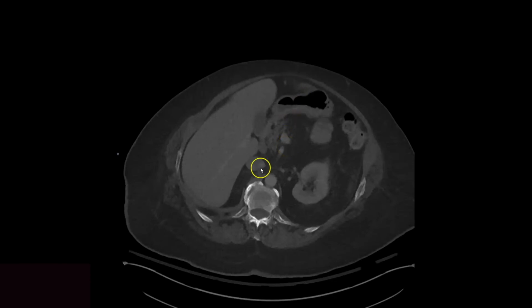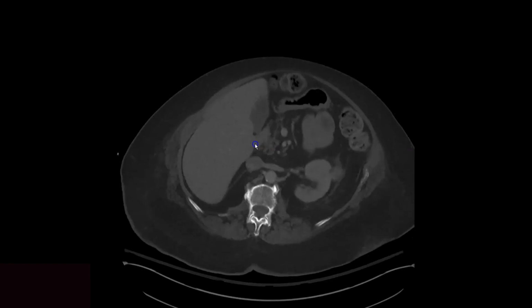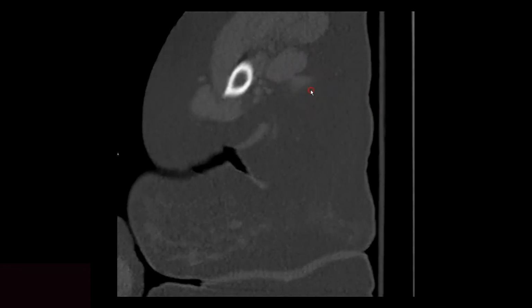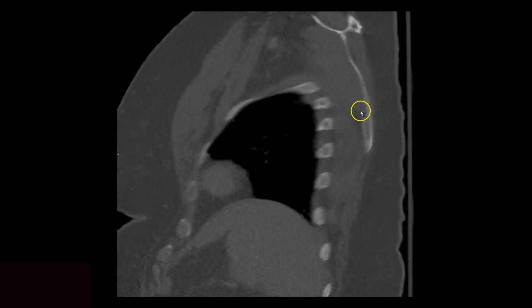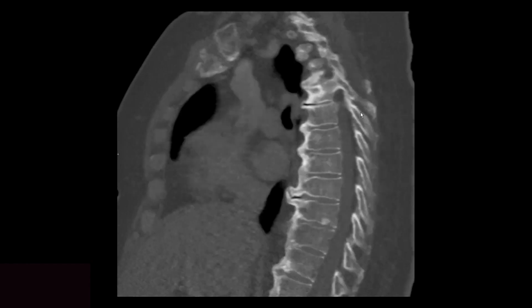And the other point, since we're here, for all you beginning radiologists, is that when we started reading these things, they were all done on film and they were all axial images only. But now we have the benefit of multiplanar reformats, and especially for fractures, if you do not look at all 3 planes, you will miss fractures that are in the plane or near the plane that you're looking at. So if you're in the axial plane, you'll miss axial or oblique axial fractures. If you're in the sagittal plane, you'll miss sagittal fractures, and in the coronal plane, you'll miss coronal fractures. So always look at all 3 planes. I've been burned many a time on this, and if you're not doing it, you will be too.